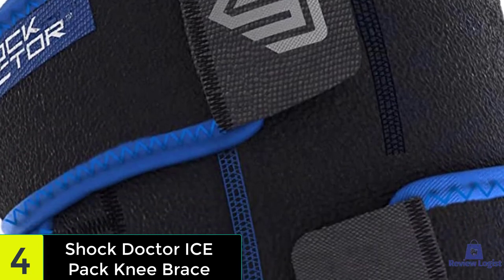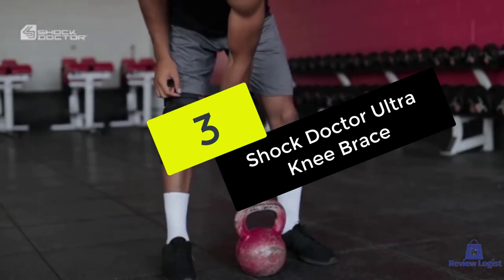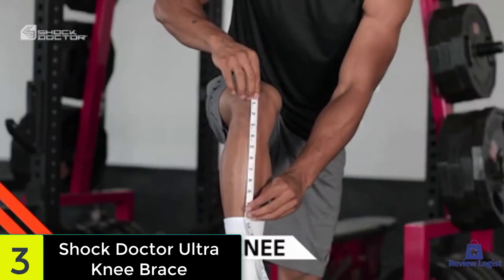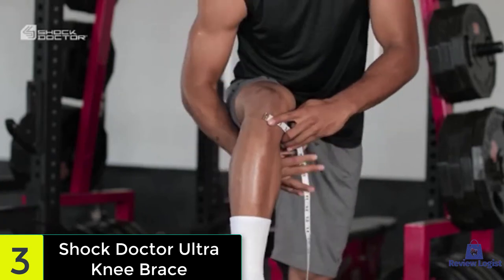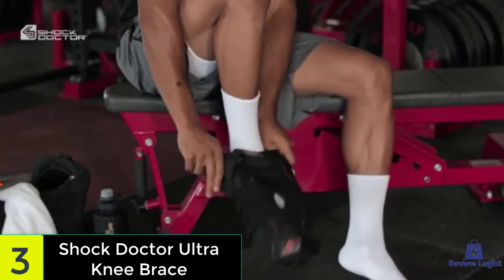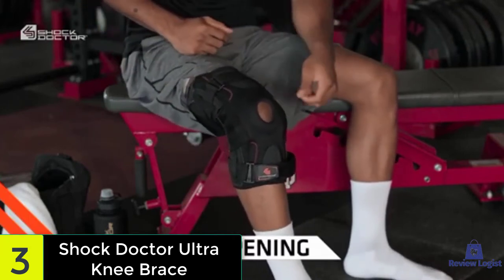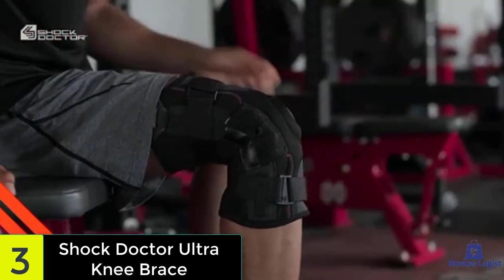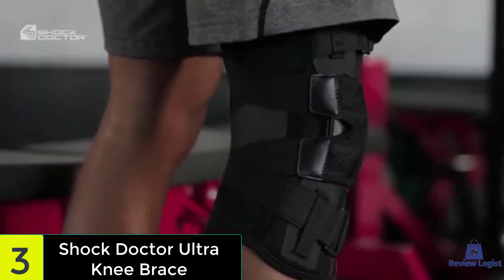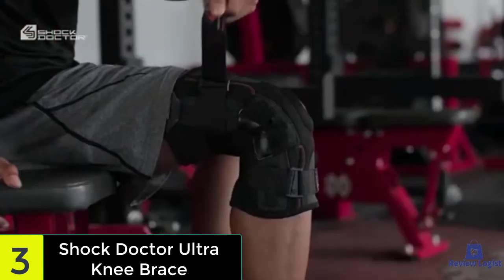At number three, we have the Shock Doctor Ultra Knee Brace. This brace is built like a tank but soft and comfortable to the touch, as it's made from a combination of Lycra and neoprene, which is soft, elastic, hypoallergenic, and easy to wash. The material wicks away moisture but keeps the body's natural heat to aid in healing through warmth and increased blood flow. The padded patellar opening offers support for the kneecap, while aluminum stays make sure your knee can withstand side impact without faltering. The patent-pending straps make this a one-size-fits-all brace that fits snugly without squeezing the sensitive joint, and it comes with finger tabs to make it easier to pull on.